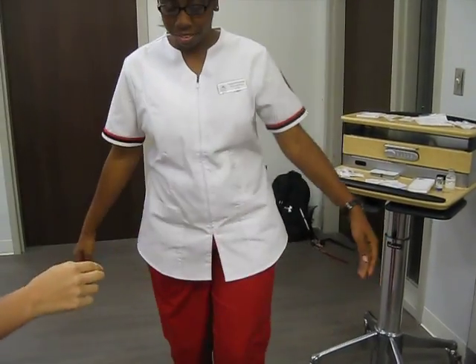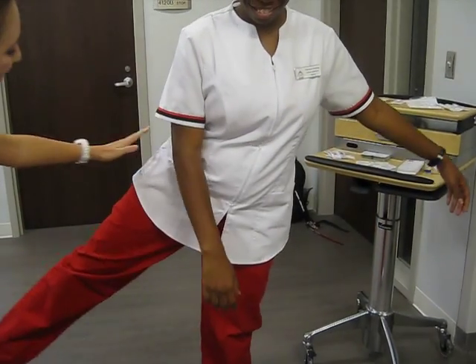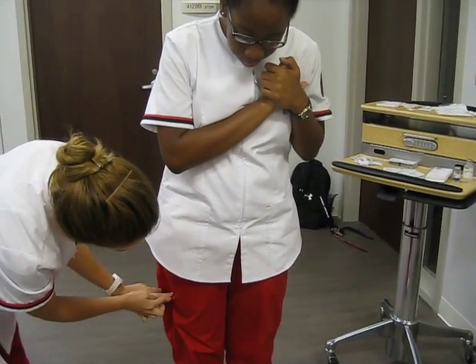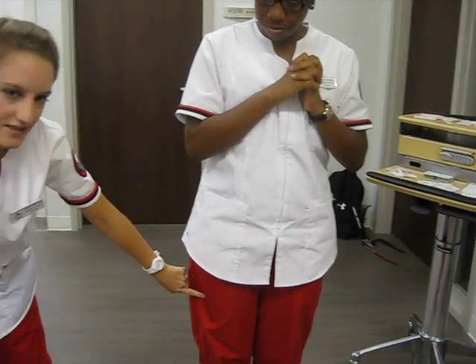Can I have you turn around? And now I will get you to lift your leg. Find that greater trochanter, and find the patella. Then I will come and meet in the center, and this would be my injection site for my vastus lateralis.